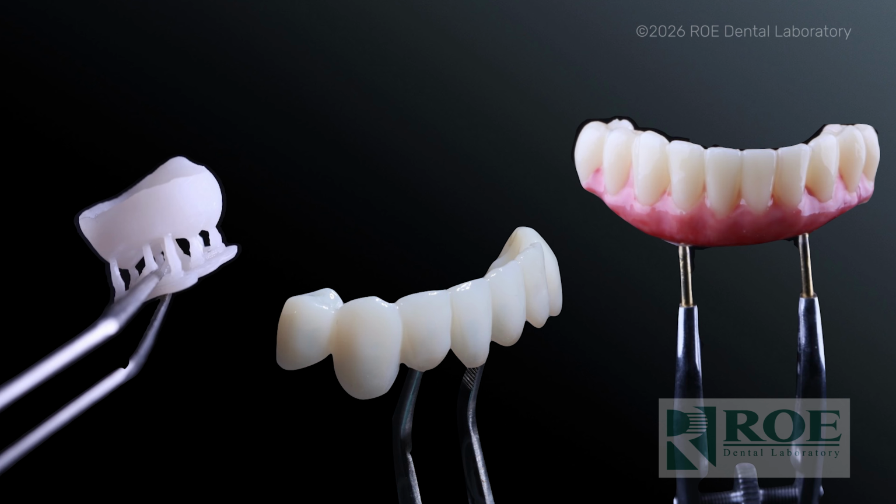For a single central or a single posterior crown, yes, just snap a bisacryl, do it really quickly. But the moment you start getting into multi-unit or bridges or quadrant or full arch dentistry, things change because the complications change, the things that we're testing change, and we need to change our workflow in order to do that.